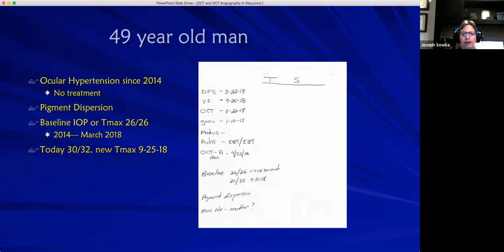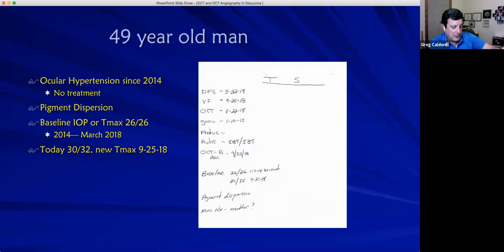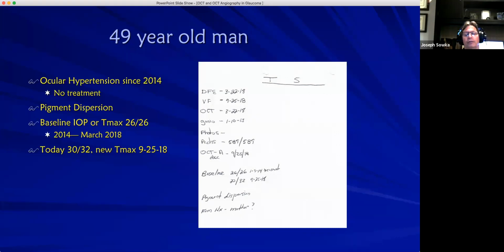What are your thoughts on using ERG in glaucoma diagnosis, Greg? That was one of our chat questions. I'm going to maybe defer to you, Joe, on this one. For decades, the companies have reached out for me to consider putting ERGs and all the electrodiagnostics into practice, and every time I've gone to a show, I've come close to pulling the trigger. I don't want to speak positively or negatively about it because I have zero experience. I like to speak from clinical experience and how I do things in practice, and that's how I teach. I'm sure there's a positive aspect to it, and in the diagnosis of glaucoma I'm sure it would be helpful. There's a fair amount of research in support of it.